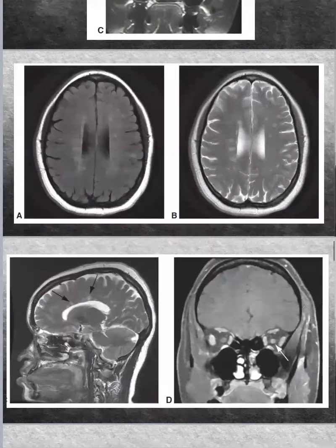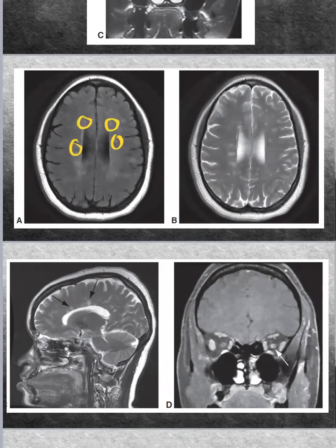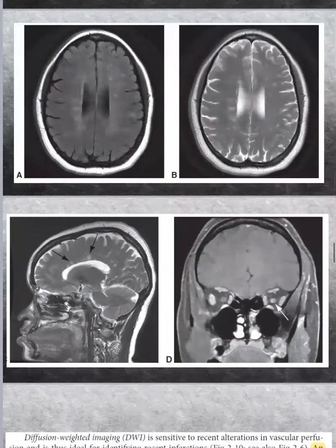Look at this one and this one. Here, this is T2 weighted. This one here is T2 weighted, but here it is with FLAIR. Can you see the proton density? I attenuated the fluid, and here I have demonstrated the white plaques or the white lesions.